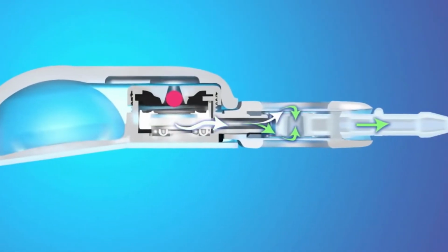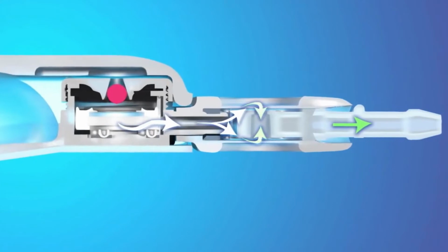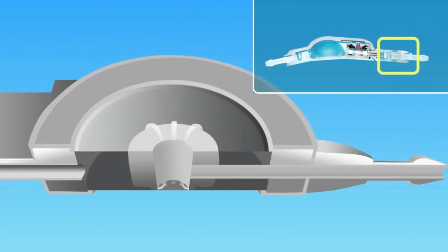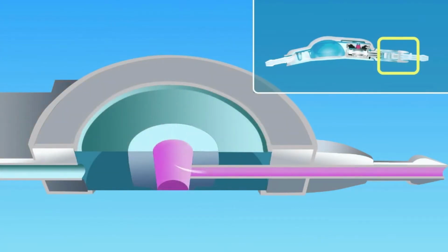Once the CSF passes through the adjustable valve mechanism, it enters the delta chamber. As discussed with the delta valve, the inlet diaphragm area is greater in size than the outlet port area, thus allowing the positive inlet pressure to control the delta chamber while minimizing the effects of the negative hydrostatic outlet pressure.